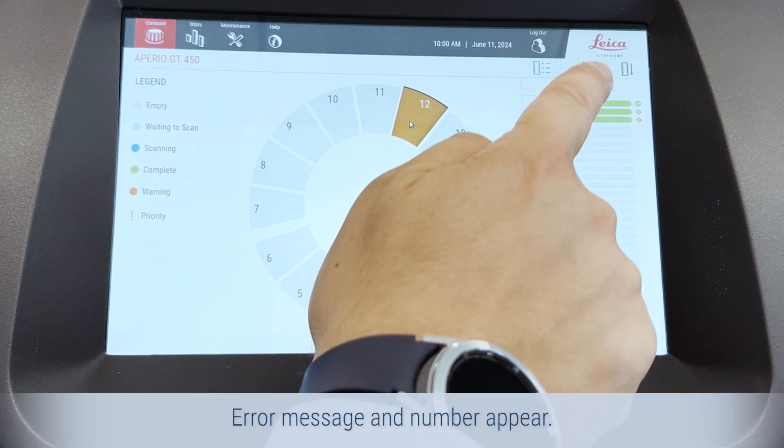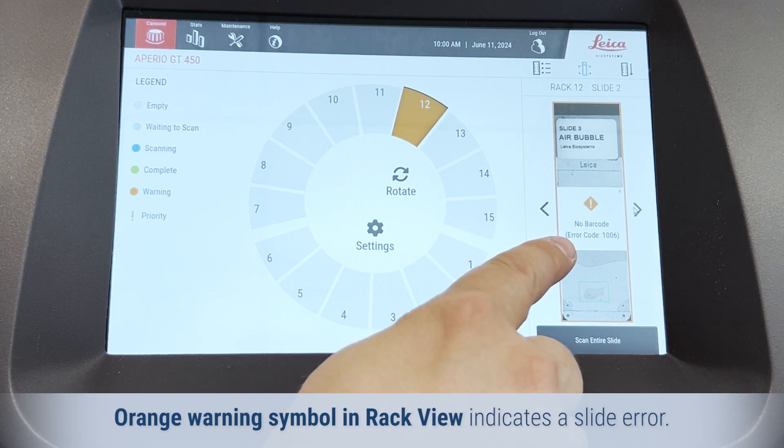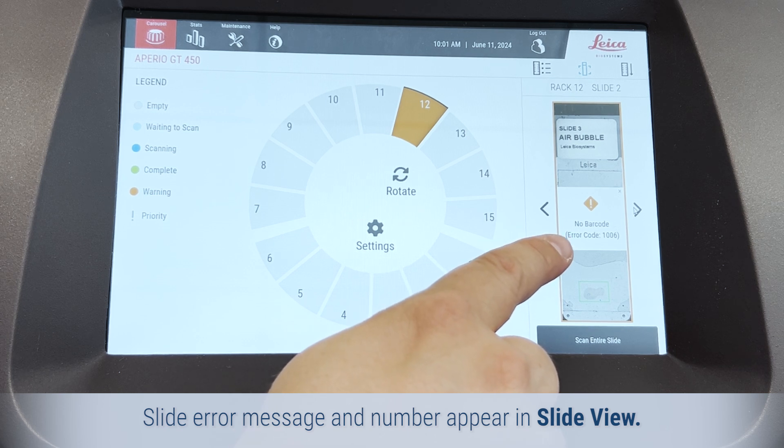Rack issues: the error message and number appear. Slide issues: an orange warning symbol in rack view indicates a slide error, and the slide error message and number appear in the slide view.